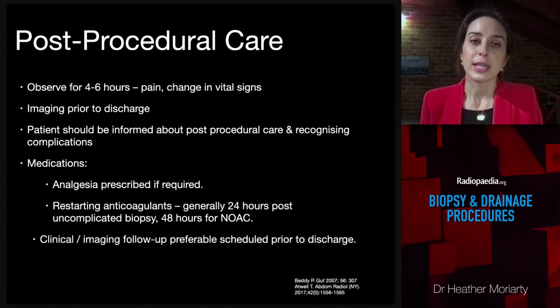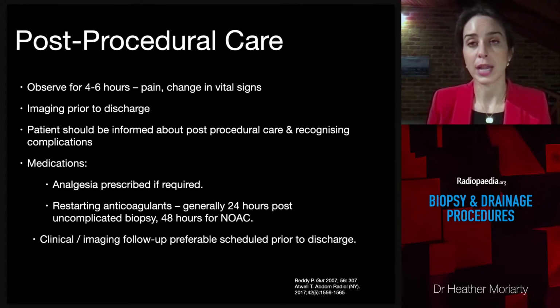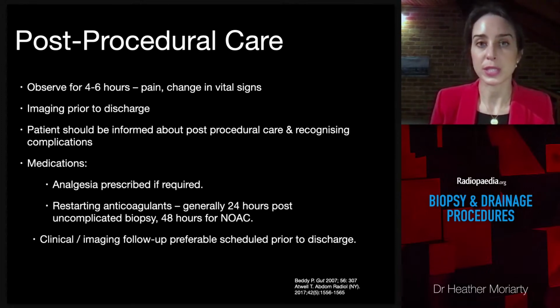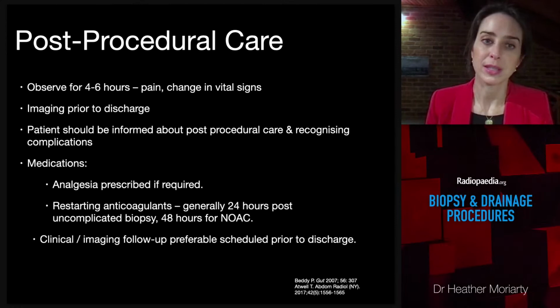If there's any imaging necessary prior to discharge, for example, a repeat chest x-ray post-lung biopsy, make sure it's reviewed and acted on. The patient or their carer should be fully informed about post-procedural care, how to recognise potential complications and what to do if they do have concerns.